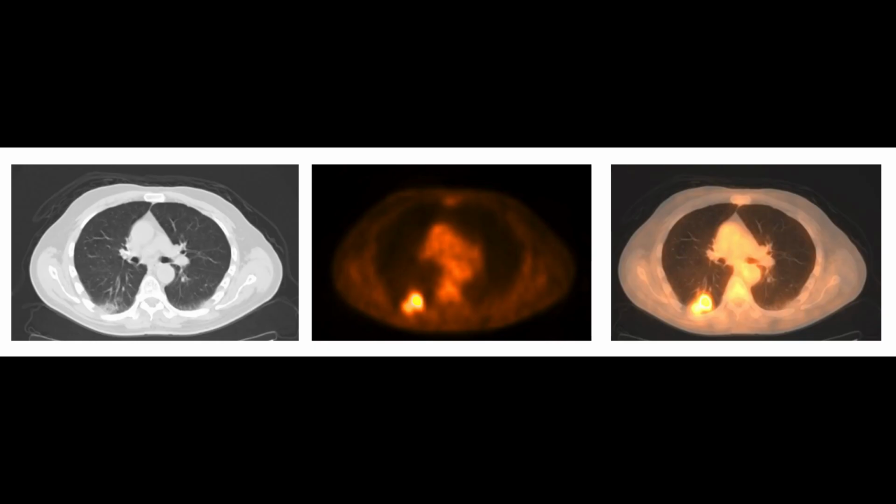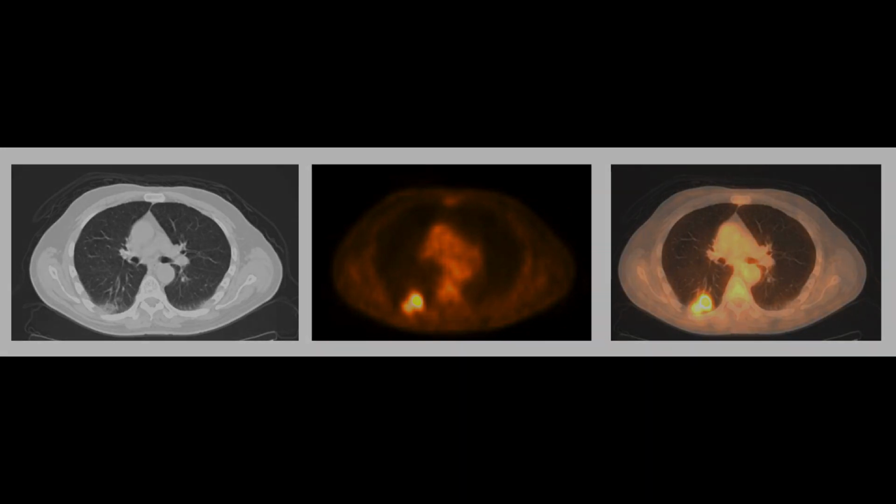So a couple of things to say about this image. One, the PET resolution is not as good as CT, as I said. Two, these PET values are represented by numerical indices, which provide some indication of the tumor burden in here. And that's called the standard uptake value. And it's basically taking the injected activity normalized by the body mass.